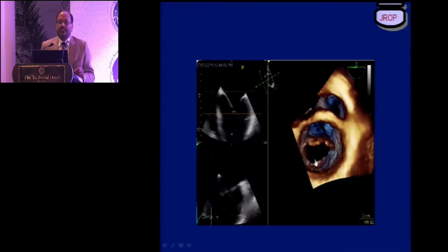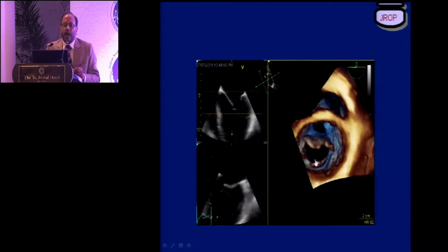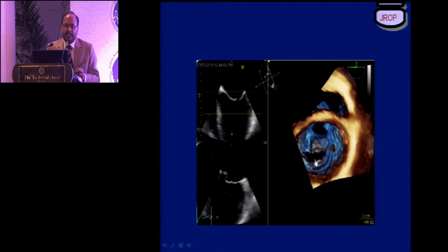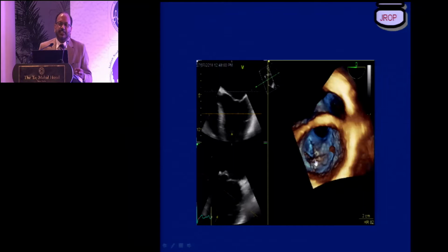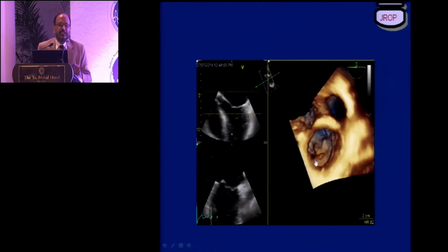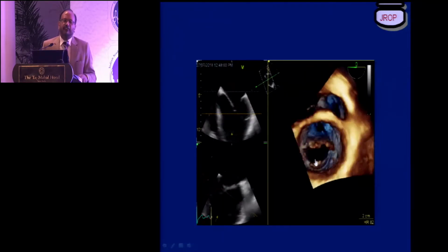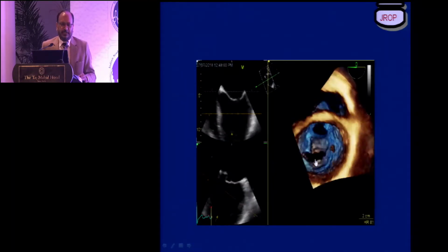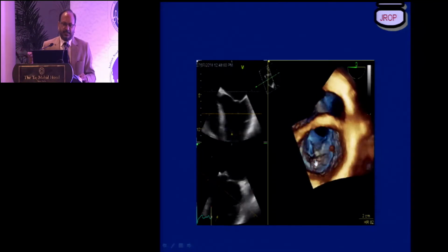This diagnosis of a cleft or split mitral valve could never have been made without 3-dimensional transesophageal echocardiography. We would still have been struggling without this kind of imaging technology. That really changed the complete scenario for this young man. And he comes back with a history: I was serving in Kargil and had a trauma to my chest, and ever since that trauma, I am breathless.